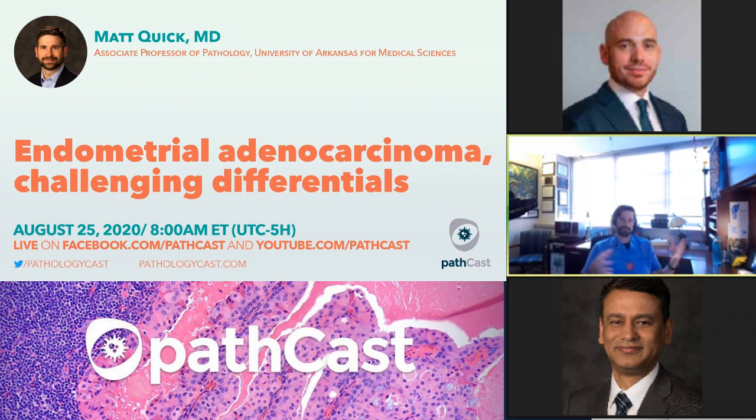And so how can you tell all the time? And I don't think you can. I often liken it to a seesaw or a teeter-totter, and you've got stains and they might stack up on one side versus the other. And sometimes the best you can do is say, well, we have more evidence for endometrioid carcinoma here than we do have for serous carcinoma. So I'm going to say high-grade Mullerian carcinoma, favor high-grade endometrioid, and that might be the best you can do.